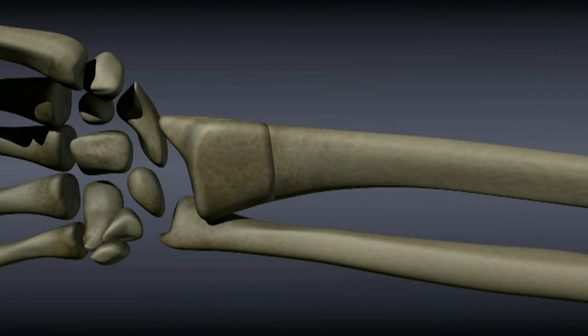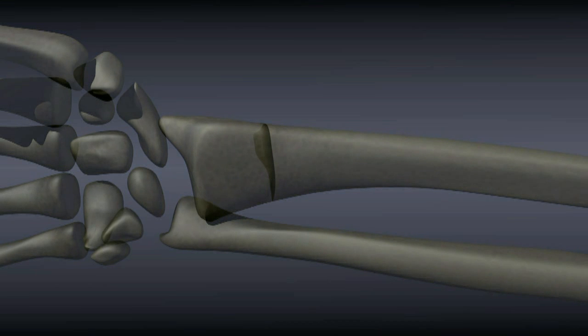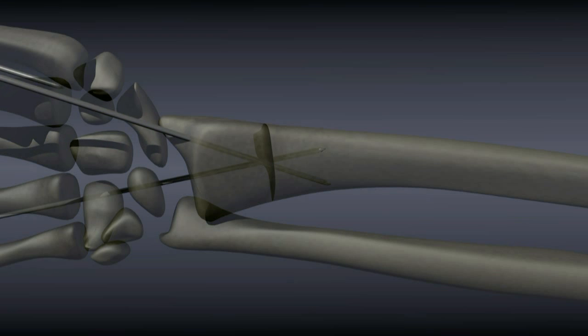Some fractures are best fixed with K-wires. Small pins are drilled into the bone to hold the fragments in place. Sometimes these wires can be placed through the skin to avoid a larger incision. However, an incision is often necessary in order to more accurately align the fragments.